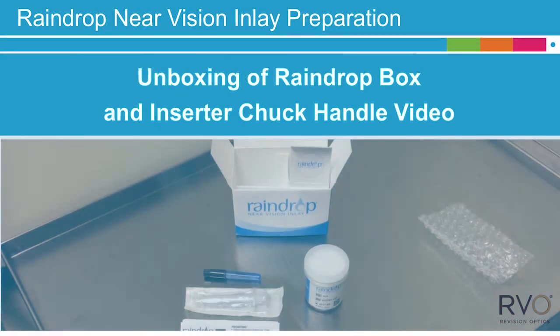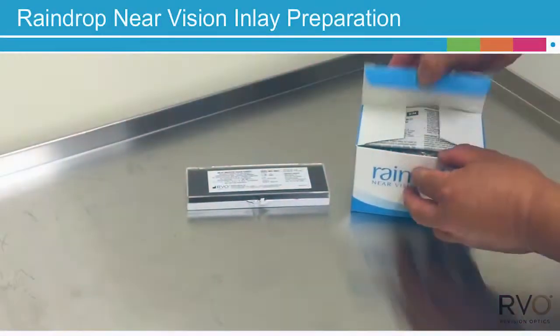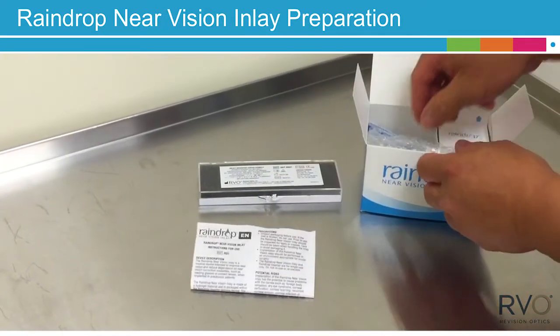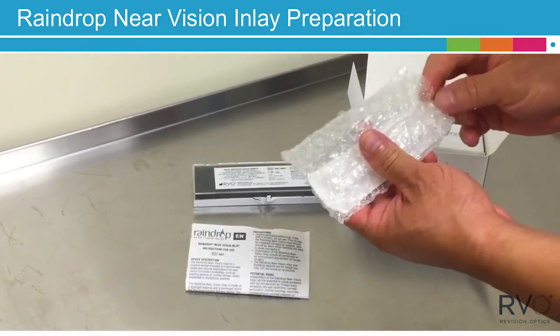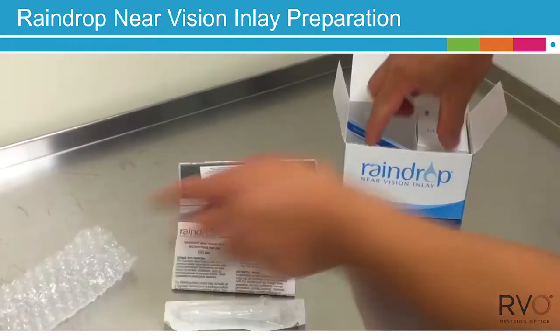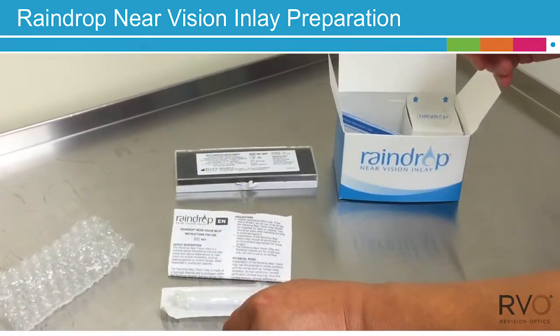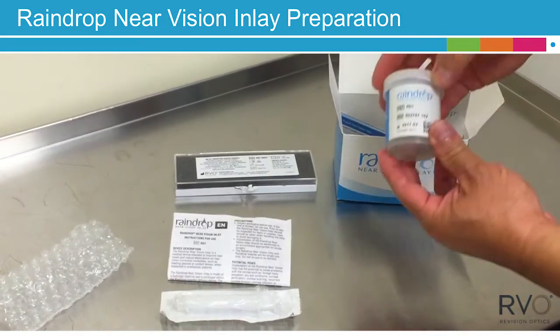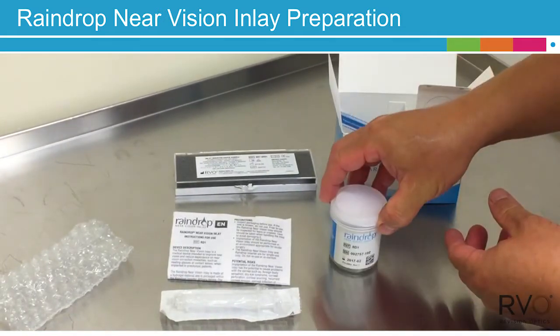Begin by removing contents from the Raindrop Box: instructions for use, a sterile 5cc syringe, a sterile 22-gauge cannula, patient information cards in a variety of languages, and finally a plastic container holding both the Inserter with Raindrop Near Vision Inlay and Serial Number Label.